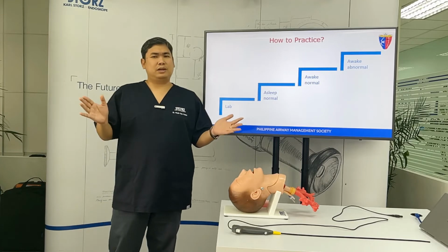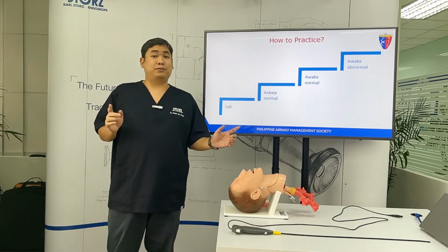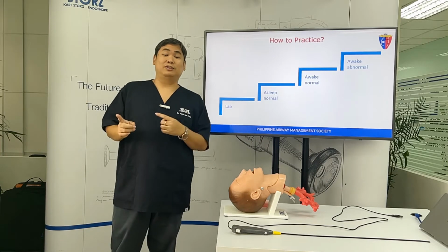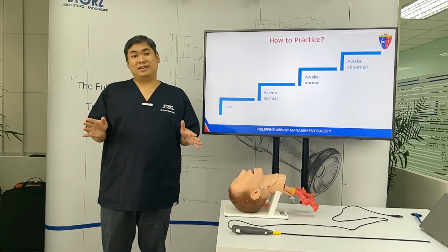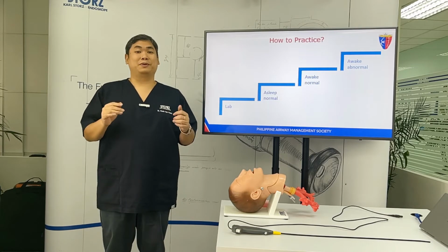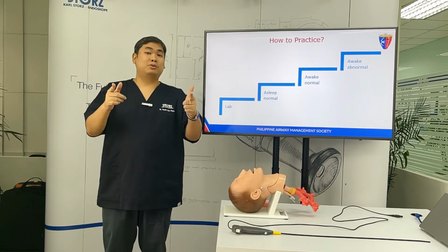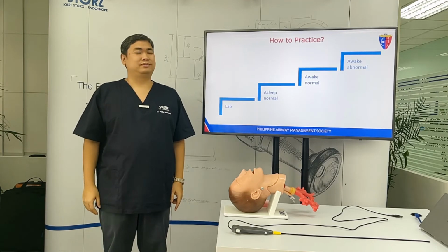So sometimes we recommend for a resident to pair up so you could perform flexible endoscopy on each other. The nice thing about this is you could feel what your patient is feeling when you perform flexible endoscopy. Or you could practice on your own.